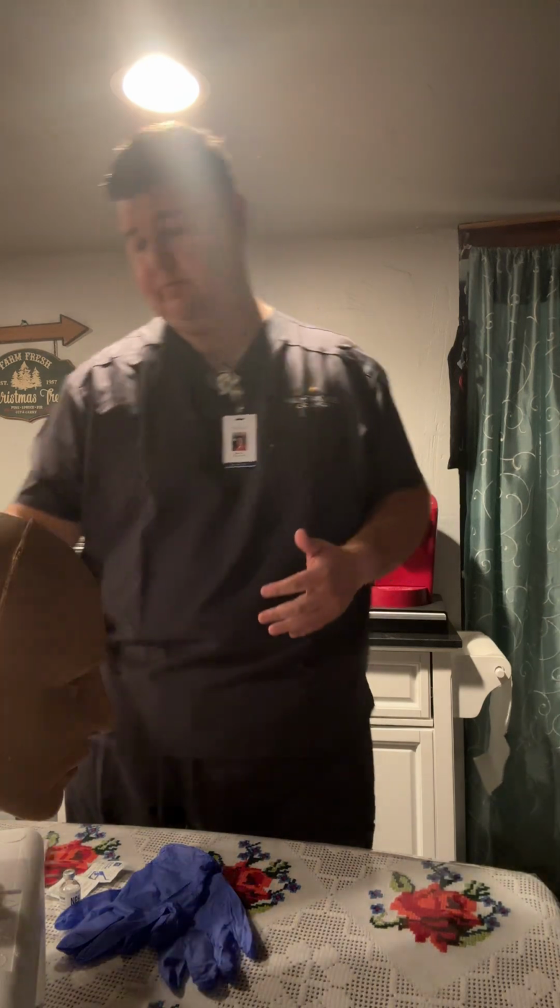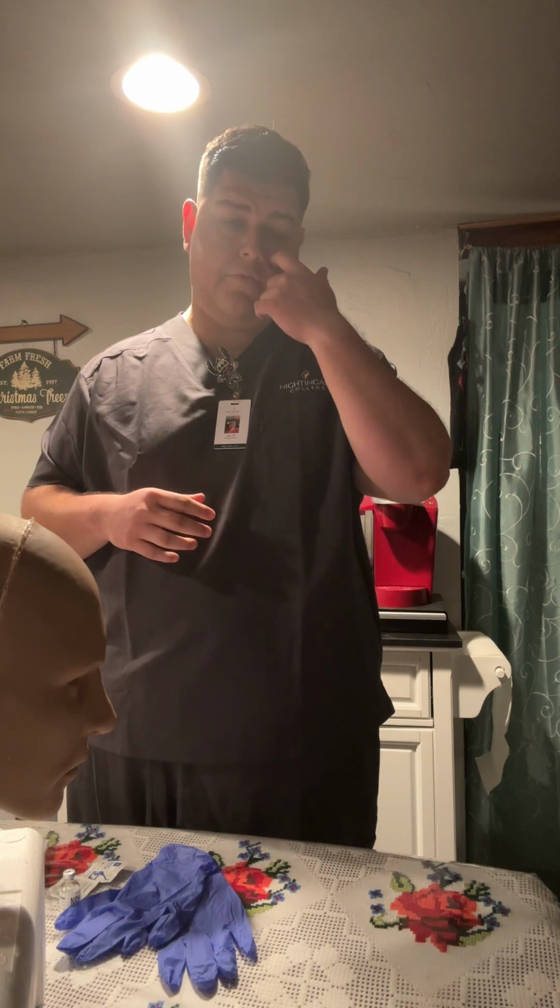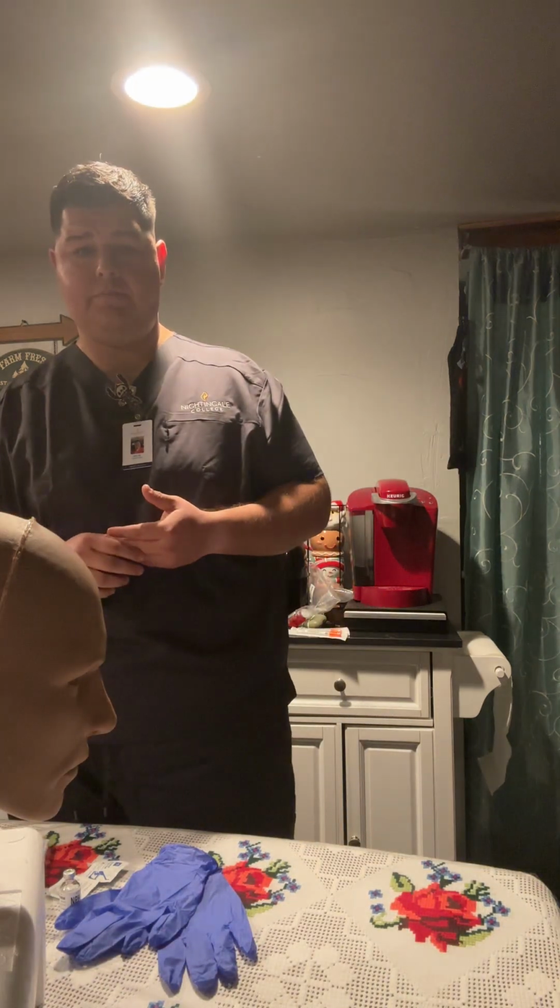From this point, I would knock, enter, close the door behind me to ensure patient privacy and avoid any HIPAA violations. I'd set my supplies down on a clean, dry, flat surface, perform hand hygiene, and introduce myself to the patient. Hello, my name is Jose. I am a nurse here. Can I have you state your name, your date of birth, and medical record number if you know it, while checking the patient's wristband almost simultaneously. I need to verify 2 patient identifiers for each and every single patient.